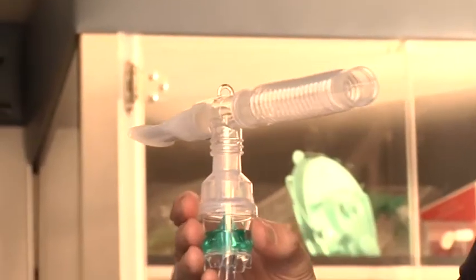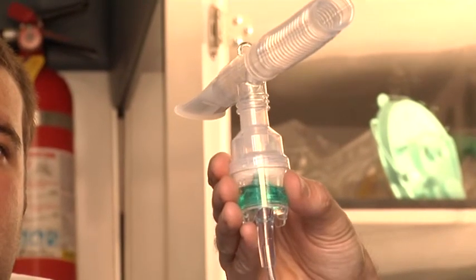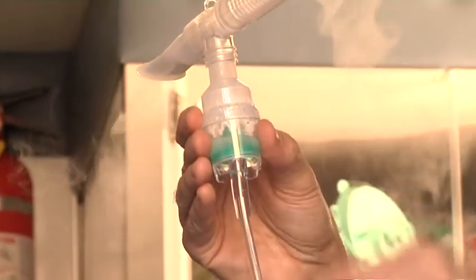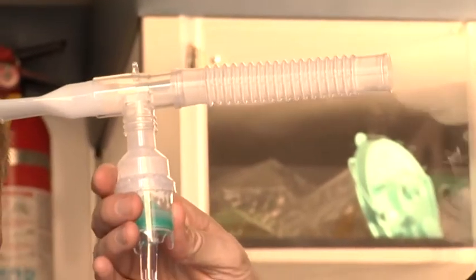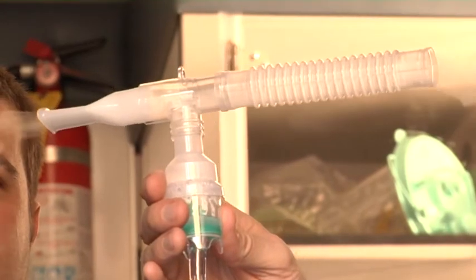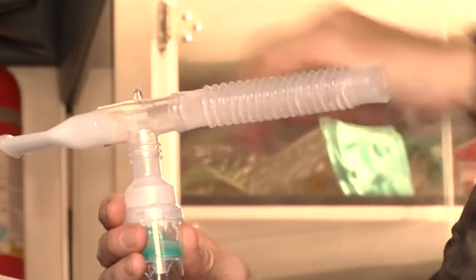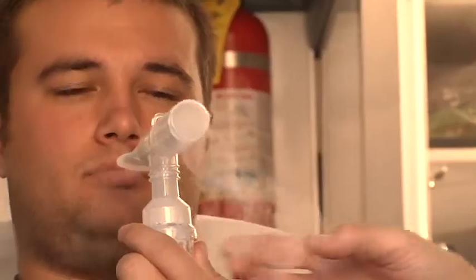Turn the oxygen source on to somewhere between 6 and 10 liters per minute. If you go much above 10 liters per minute, there's a tendency for the tube to blow off the bottom of the nebulizer and stop delivering medication. You can see the medication being nebulized out both sides. This extra piece of tubing helps to contain the medication so that as the patient breathes in and out, it pulls extra medication back into the patient. We can then hand it to the patient.